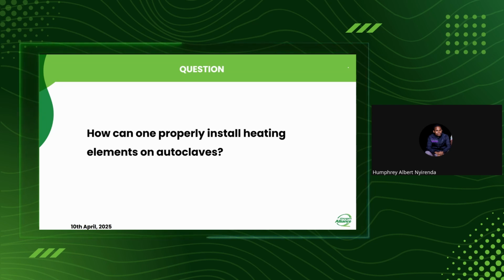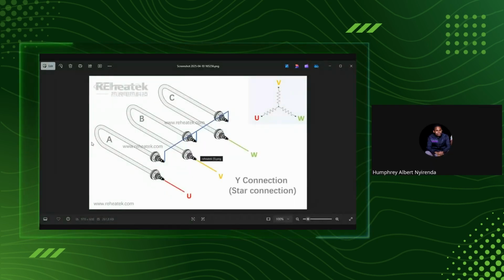You may say element 1, element 2, element 3, where element 1 has A and B as the connection terminals. You may use phase 1 to connect the A's of element 1 and element 2. Then you use phase 2 to connect the terminals of element 3 and element 2, and use the remaining phase to connect the terminals of element 3 and element 1.